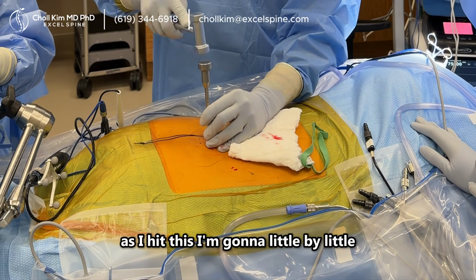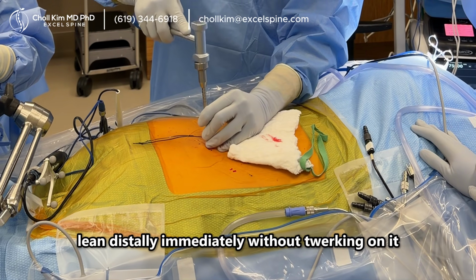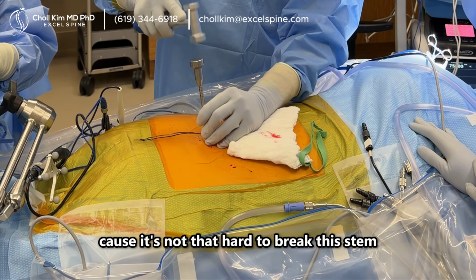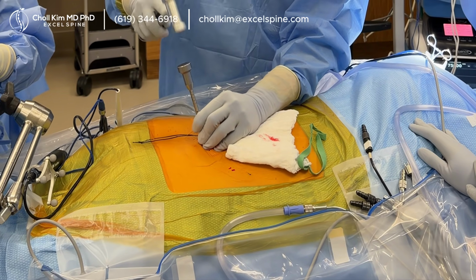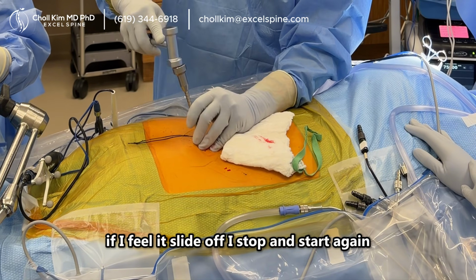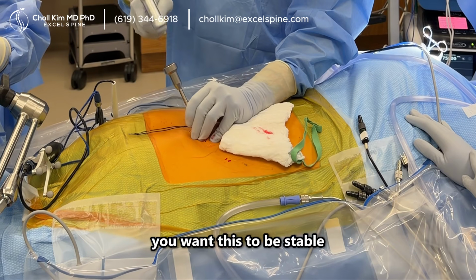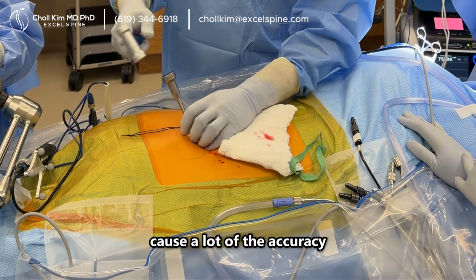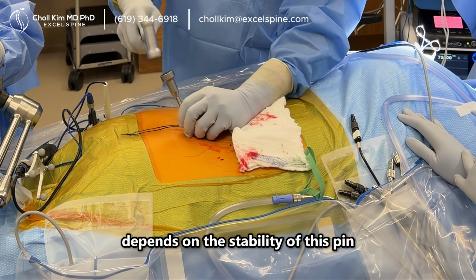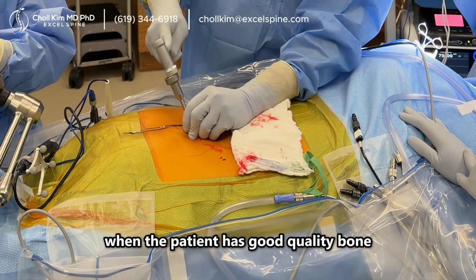Now, as I hit this, I'm going to little by little lean distally immediately without torquing on it, because it's not that hard to break this stem. If I feel it slide off, I stop and start again. You want this to be stable. You're going to rely on navigation, because a lot of the accuracy depends on the stability of this pin. Oh, that feels good. And it sure helps when the patient has good quality bone.